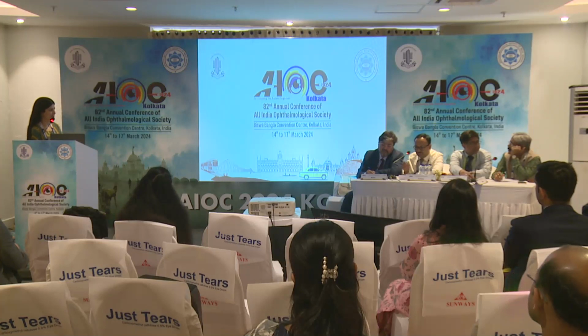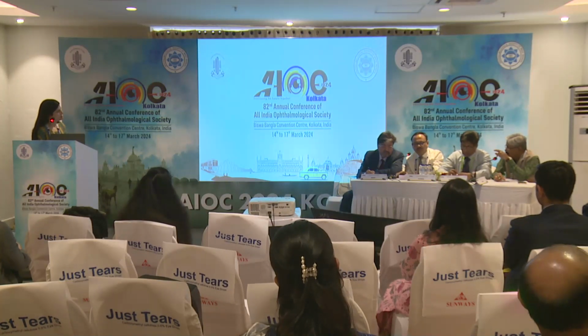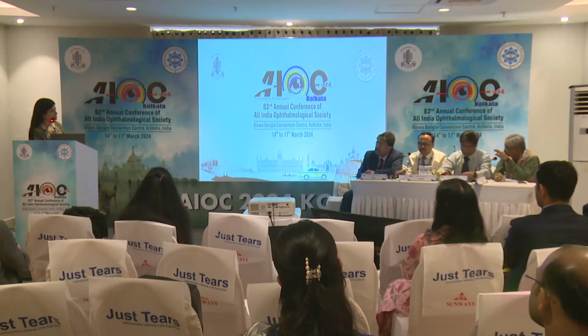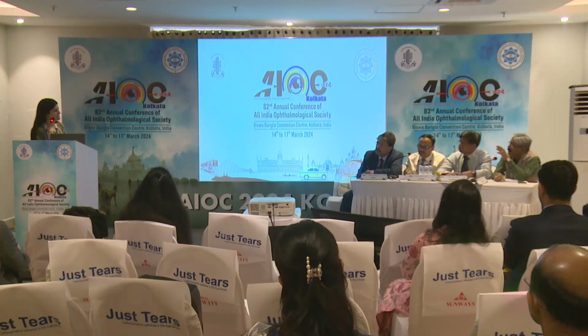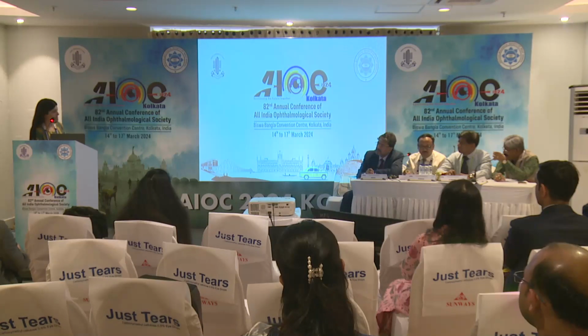Okay. Thank you. Do you not give a posterior capsulotomy? No, this was an older child. This was a 4-year-old child. We can do it, but not at the same sitting. What is the follow-up? This patient is maintaining a clear visual axis in this eye.